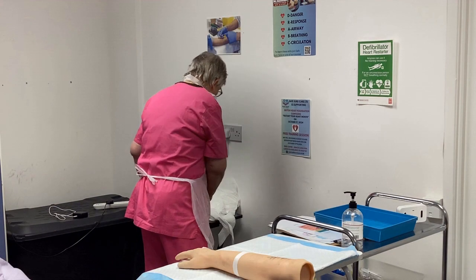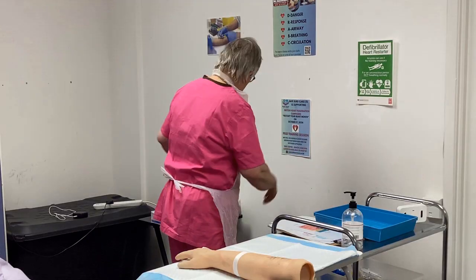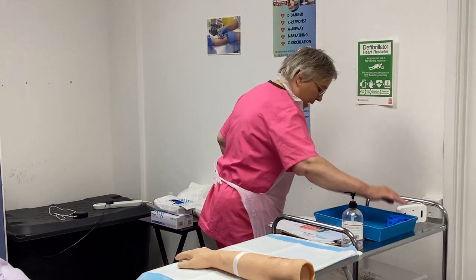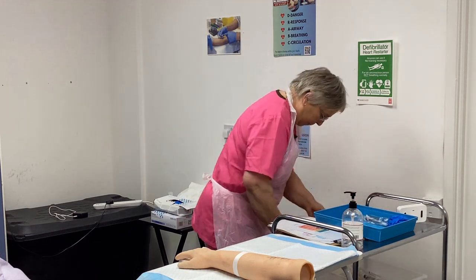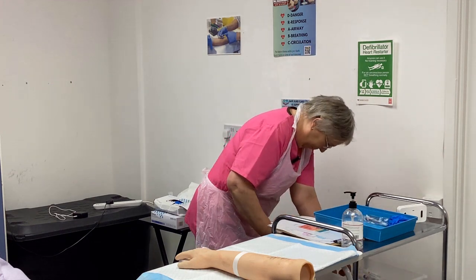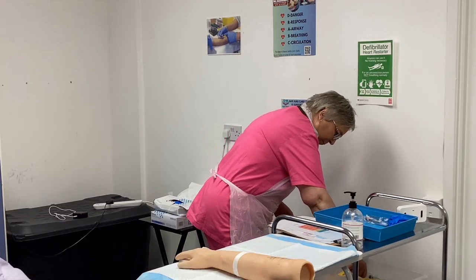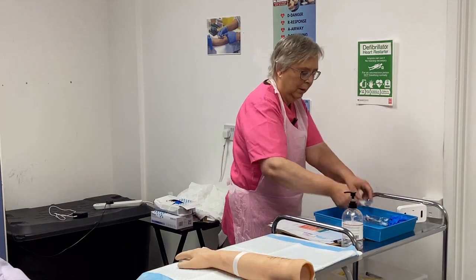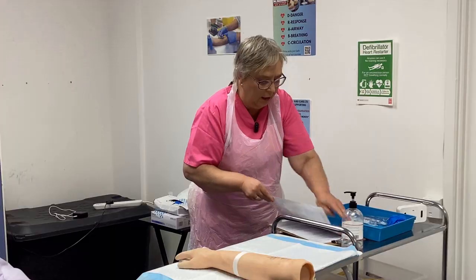Gloves out of the box. Check the expiry date, 2028. So I've got my gloves. Pop those in there. I've got my IV infusion there. I've got my mediswab. I've got my prescription here. I've got my medication.